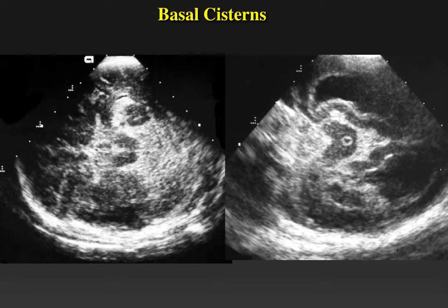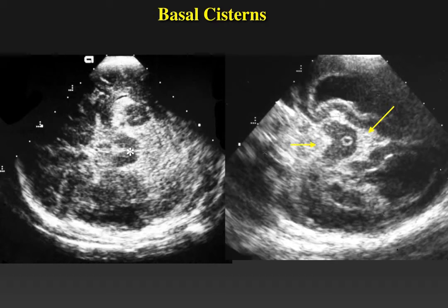The image on the left is an axial image obtained at the level of the cerebral peduncles. The asterisk shows the midbrain and cerebral peduncles with a thin and echogenic rim of basal cisterns surrounding the midbrain — the normal appearance. The image on the right shows expansion of the basal cisterns with blood in a baby with subarachnoid hemorrhage, with increased echogenicity filling the basal and interpeduncular cisterns. The blue arrow shows a dilated aqueduct of Sylvius surrounded by a thick rim of ependyma, consistent with ependymitis.